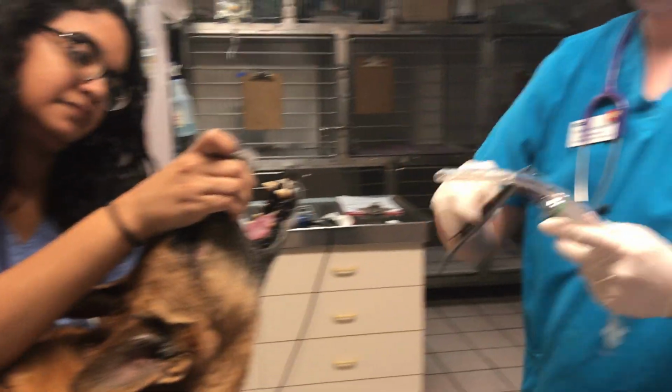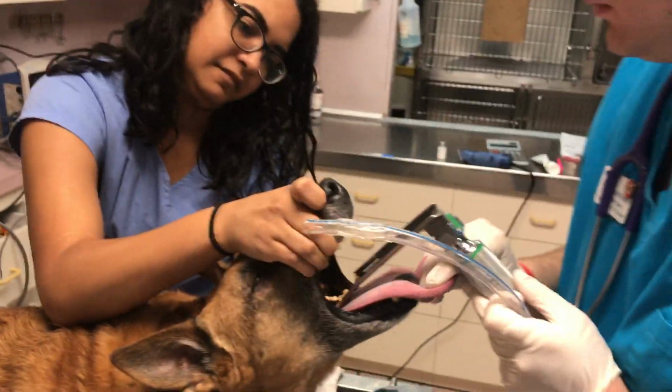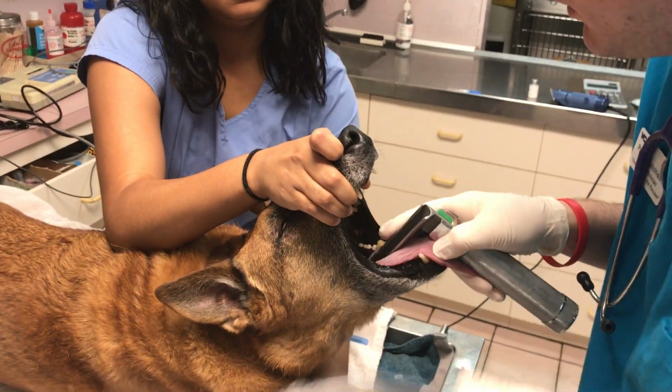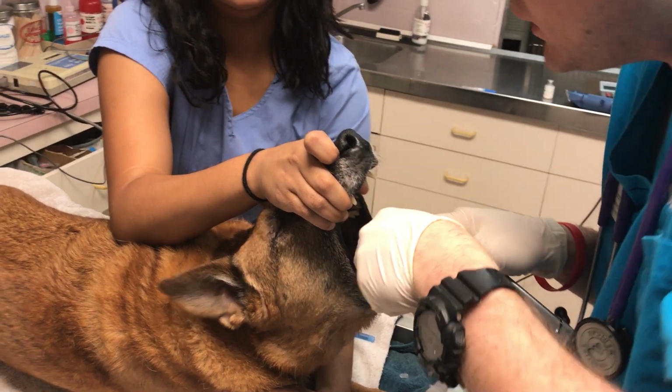Next, you're going to need a laryngoscope. Pull out the tongue. When I am here, I'm going to lift up the soft palate, pull down the epiglottis, visualize the vocal cords.